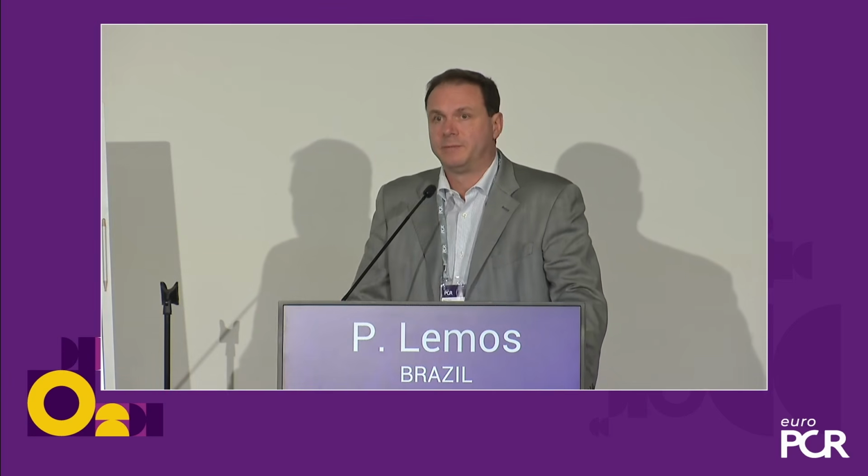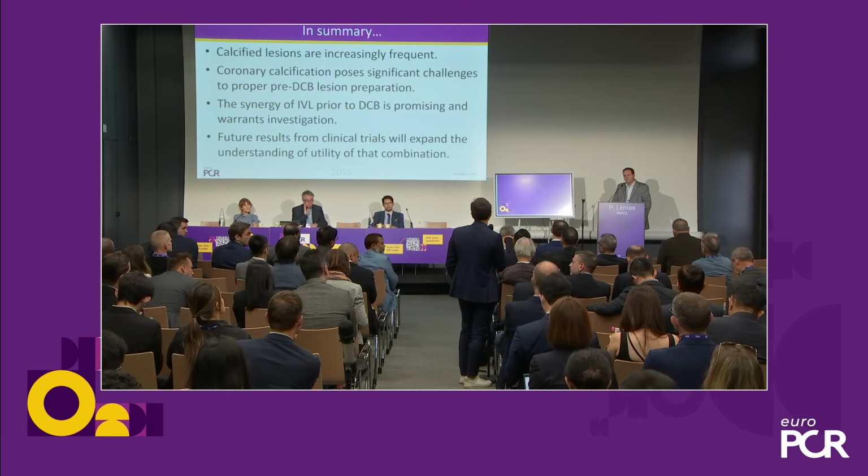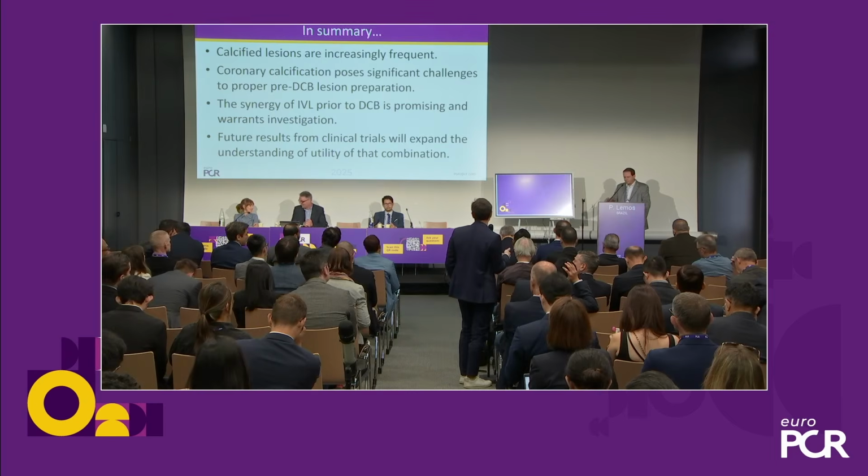If I may, why did you exclude the use of scoring and cutting balloon? Because as you just said, you need to prepare the vessel with a specific and good size device. But for the study you just presented, it's an excluding criteria. That's a bit strange. Why?